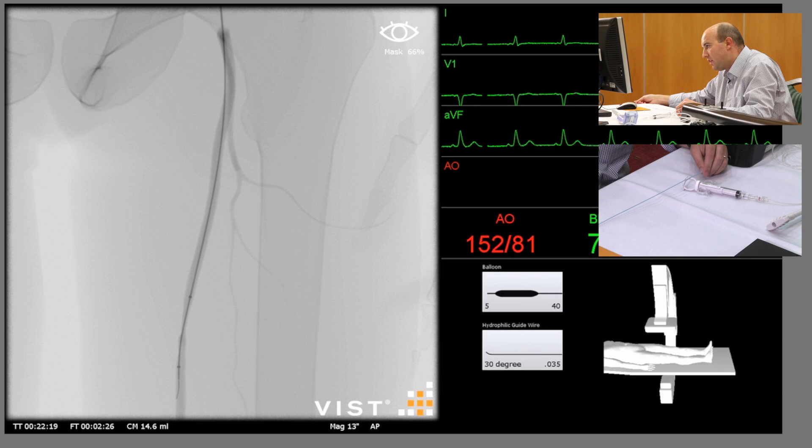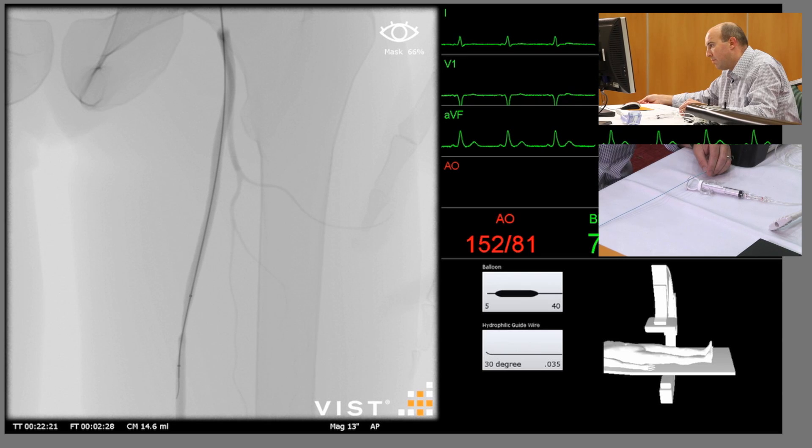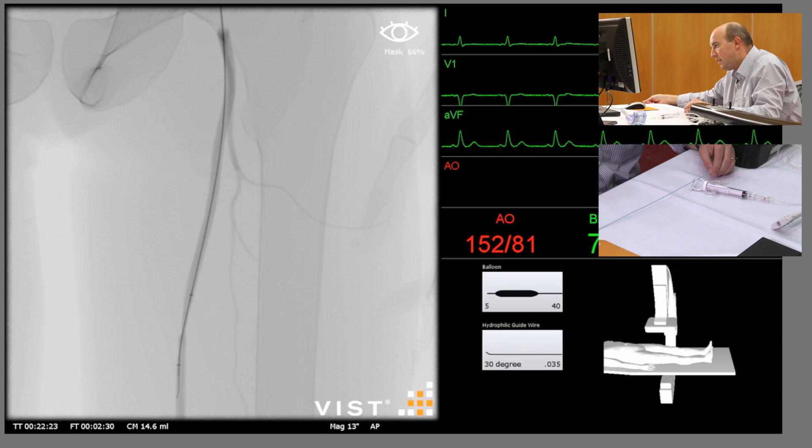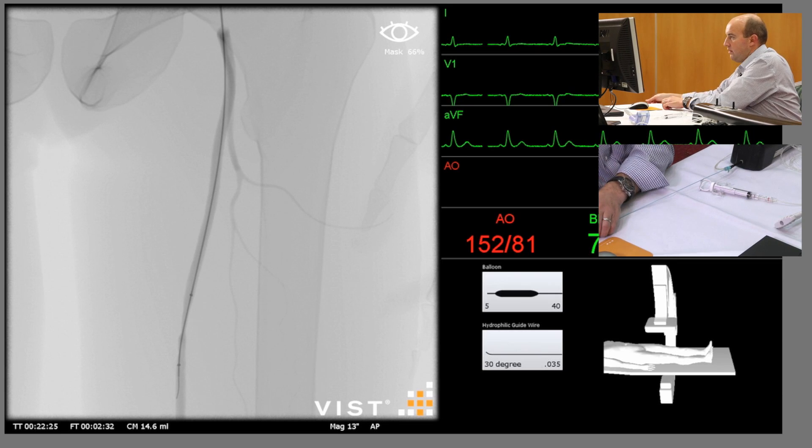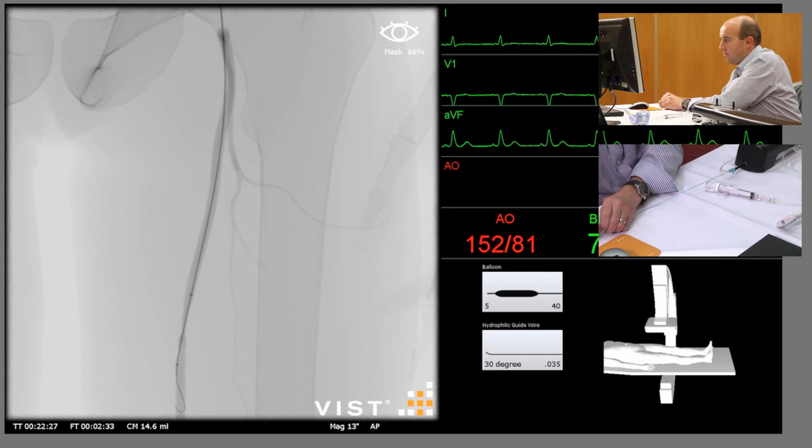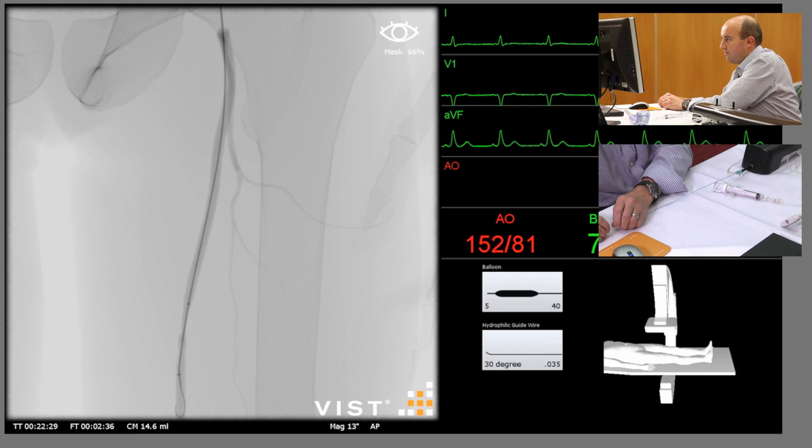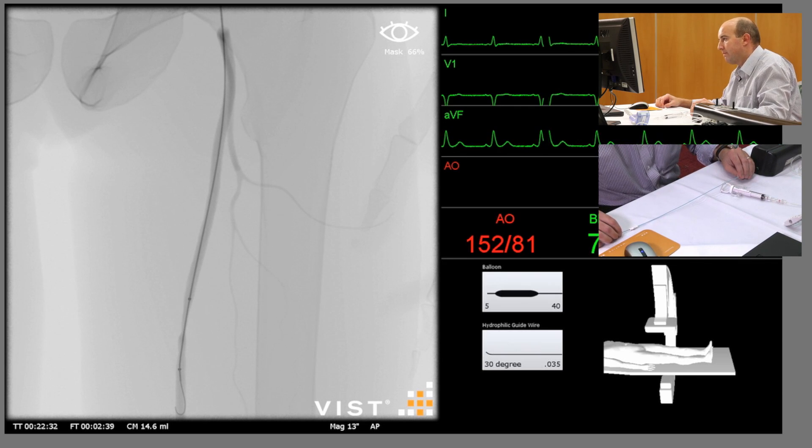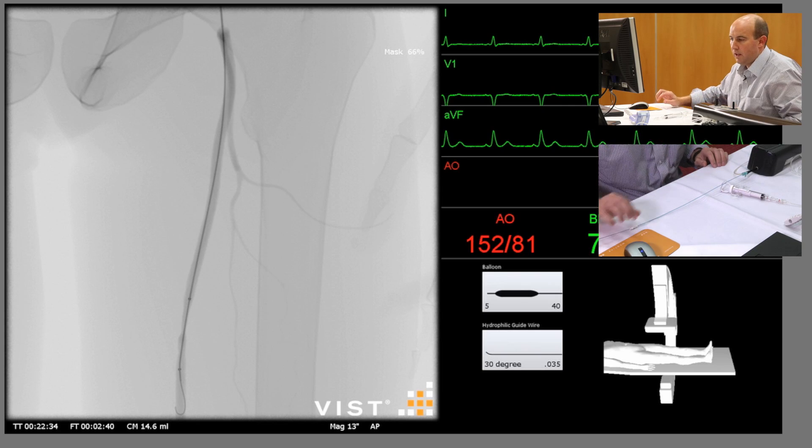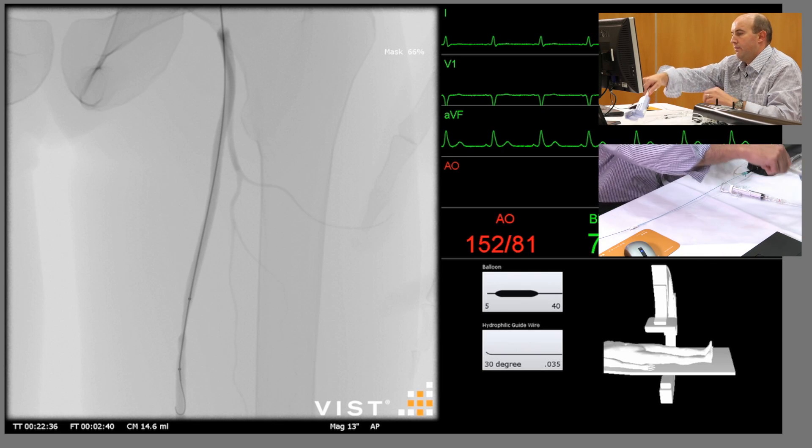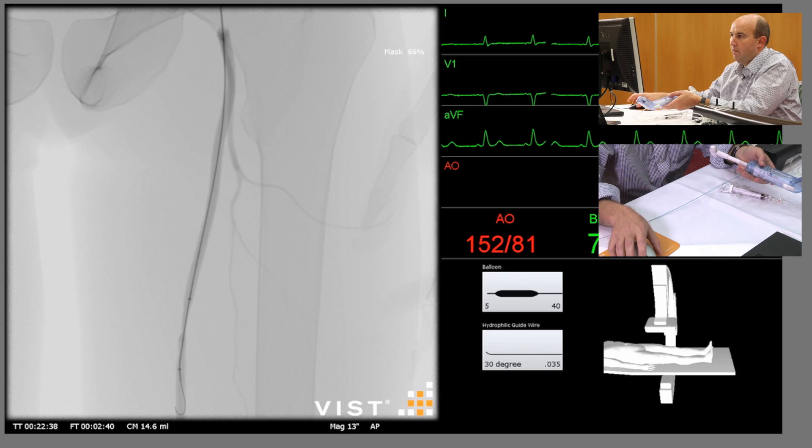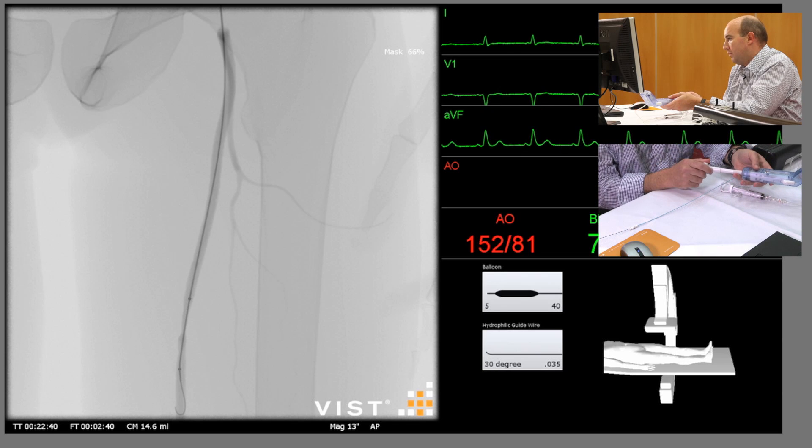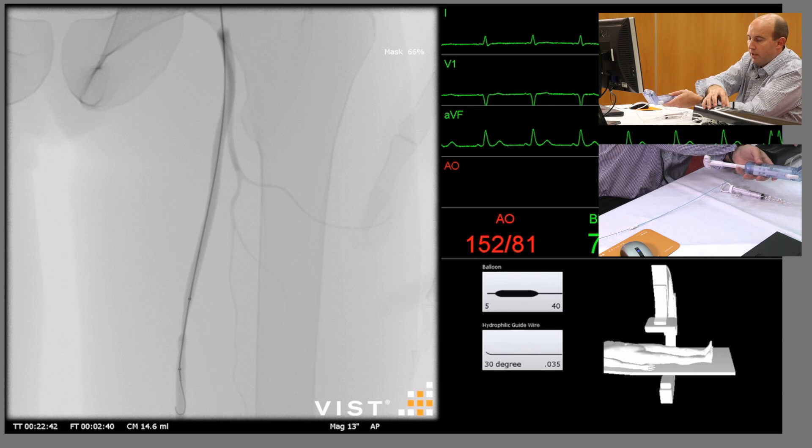The two markers at each end of the balloon, so the midpoint of the balloon should be in the middle of the disease. So that looks about right. I would tend to put a wire a little bit more in, bring that balloon back. Okay.